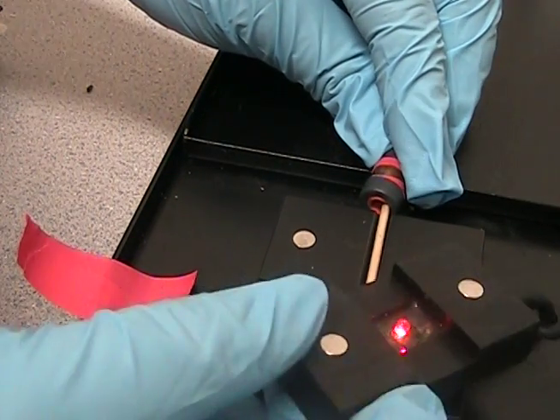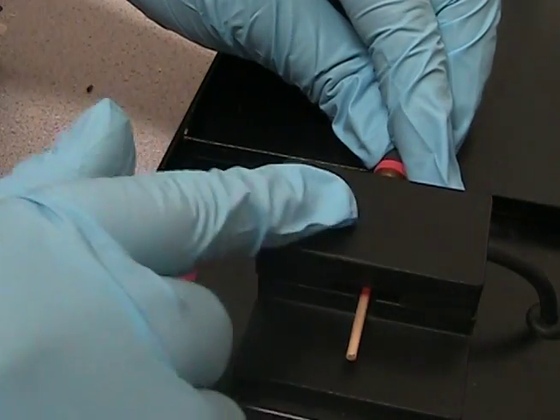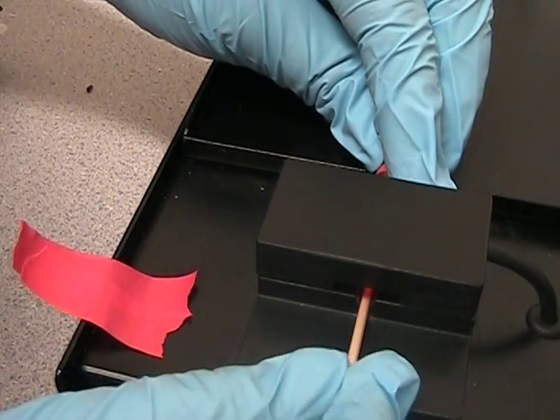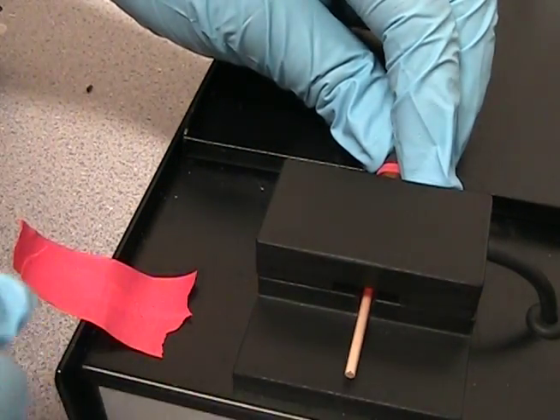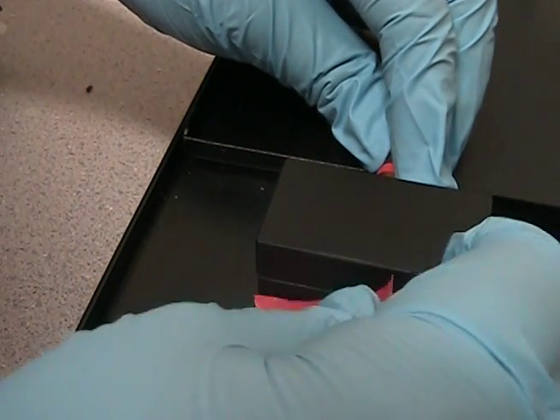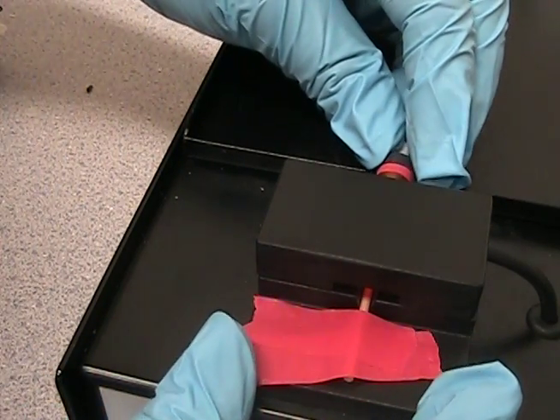We place this electric eye over — this is actually the machine that records the reading. Sometimes the mouse's tail will slip through, and we don't want that to happen. So we use tape and tape it on like so, so that way we can get an accurate reading.